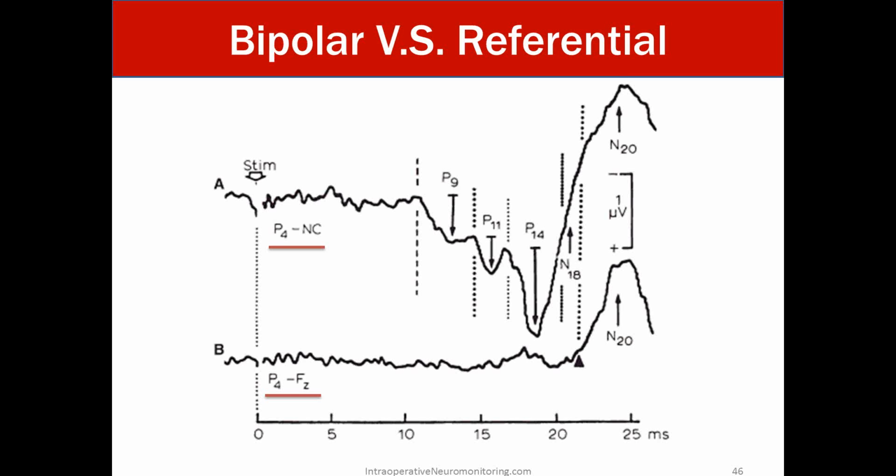It's going to be on some old clunky machine, probably some 4-channel, and it's going to look like this. Be it EEG or BAERs or whatever it might be, I always recommend looking first at the picture and just scrutinizing it, tearing it apart, and knowing what's on the screen before you even look at the question.